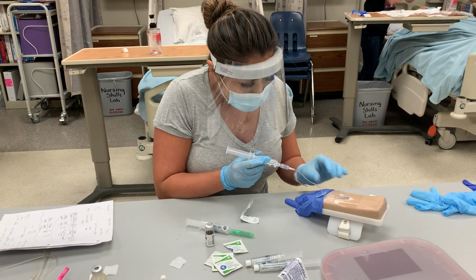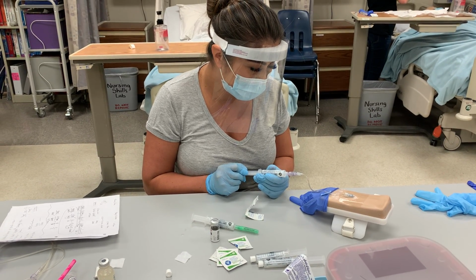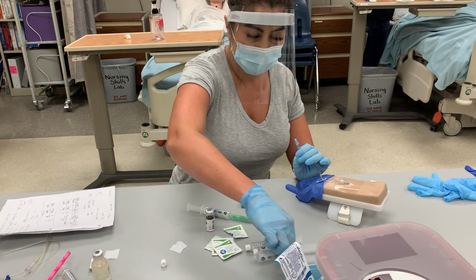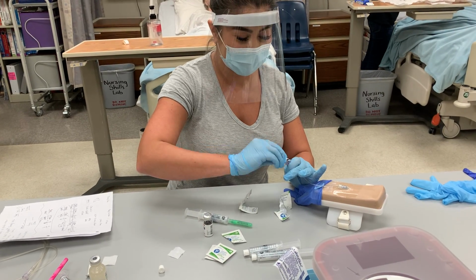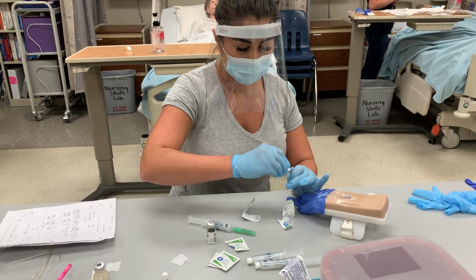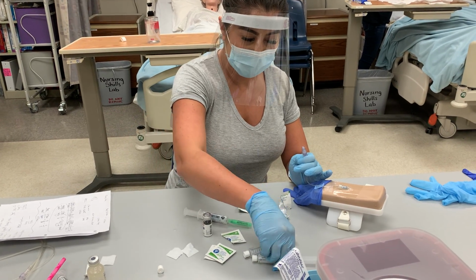Make sure this is open. I'm going to gently pull back to see if I get blood return. I can see it's coming back. So I would dispose of that. Clean this, scrub the hub for 15 seconds. Oh my goodness. Okay, now I'm going to get my next flush.